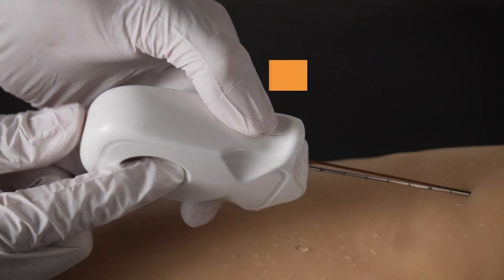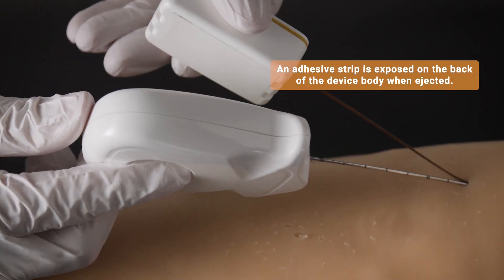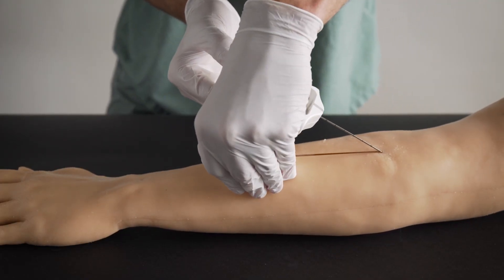When you're ready to separate the needle introducer from the monitor, push through the opening on the back of the device. This will expose an adhesive strip which can be used to affix the device onto the patient's extremity.